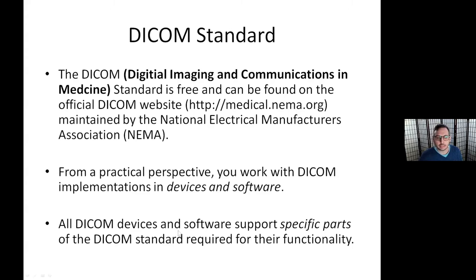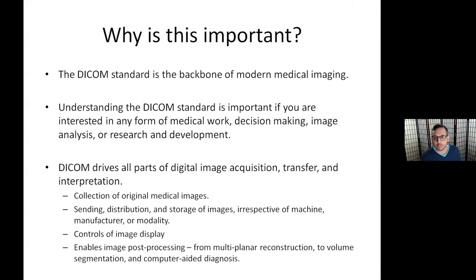All devices and software work with specific parts of DICOM, because DICOM is a very large structure and it's not used by all different elements. So each device has a conformance statement that says what part of the DICOM standard it works with. As I've already shared, and I understand that I'm a little repetitive, this is just what I do.